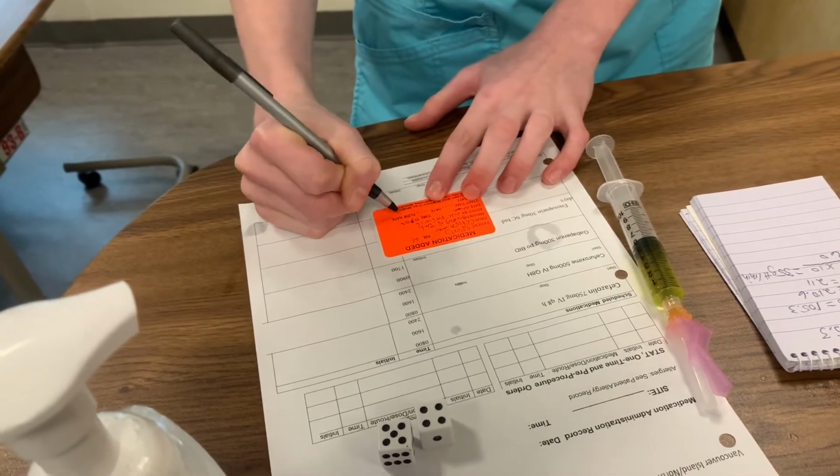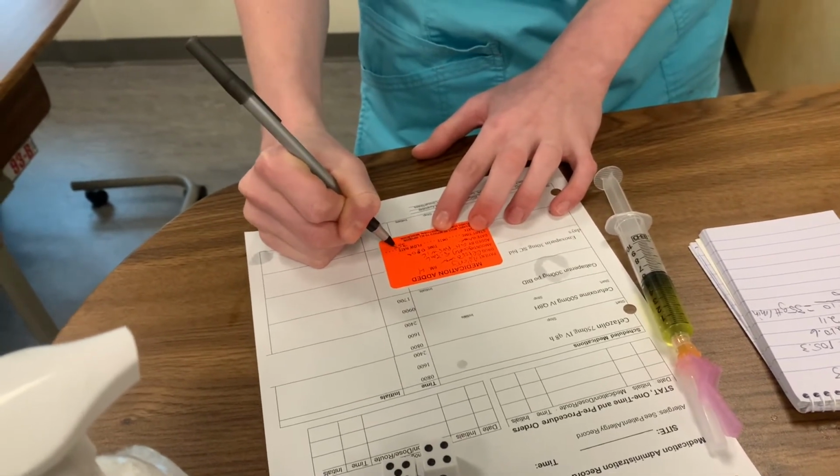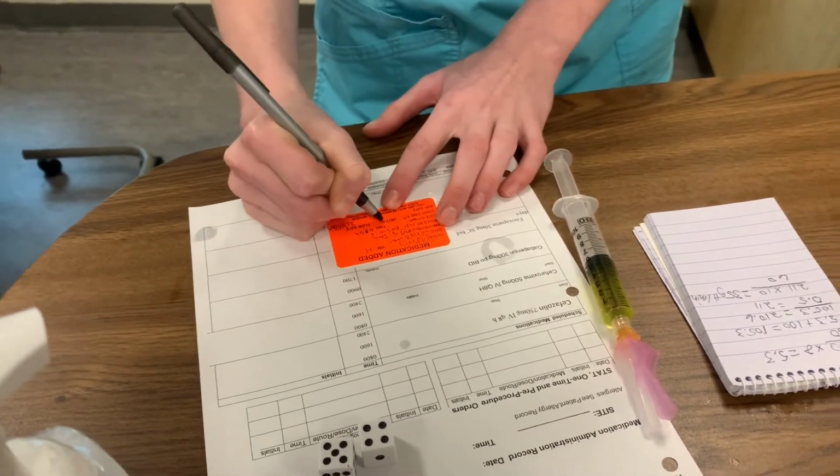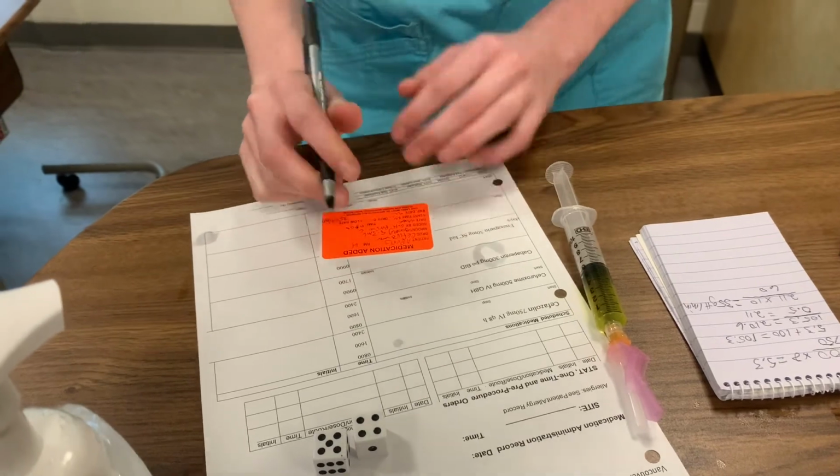Flow rate is 35 drops a minute. Start time is now and expires at that time.